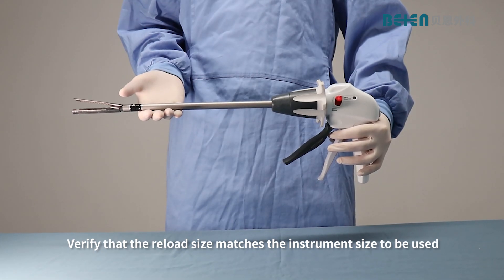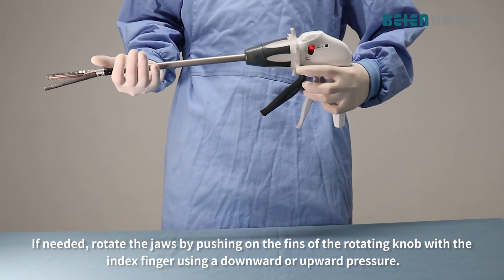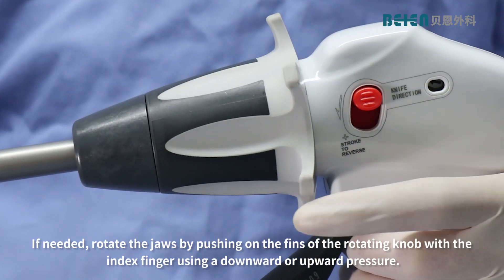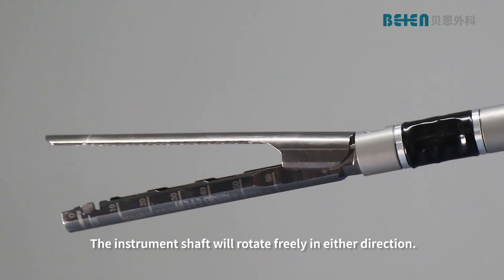Verify that the reload size matches the instrument size to be used. If needed, rotate the jaws by pushing on the fins of the rotating knob with the index finger using a downward or upward pressure. The instrument shaft will rotate freely in either direction.